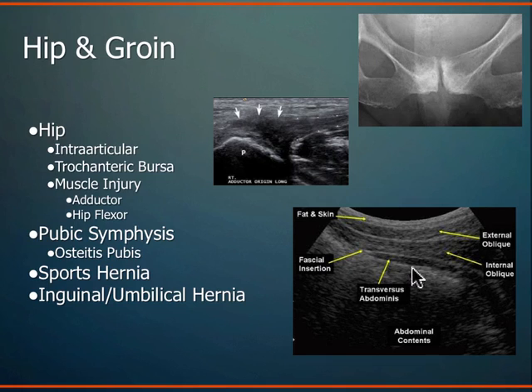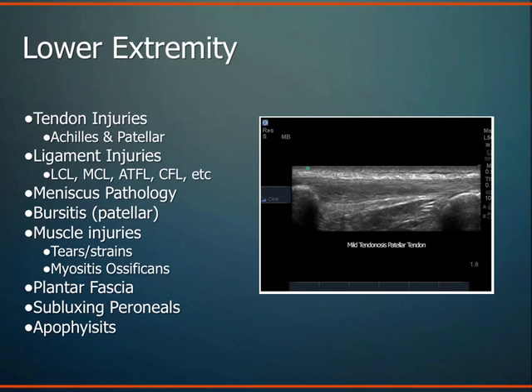Another very common source of pain in the groin in athletes particularly is osteitis pubis, or just kind of chronic changes at the pubic symphysis, inflammation. And the best way to work through your differential on that is to inject it. And it's obviously a sensitive area to inject, so you want to have image guidance. And you can see it quite well on ultrasound and use ultrasound guidance for those injections.